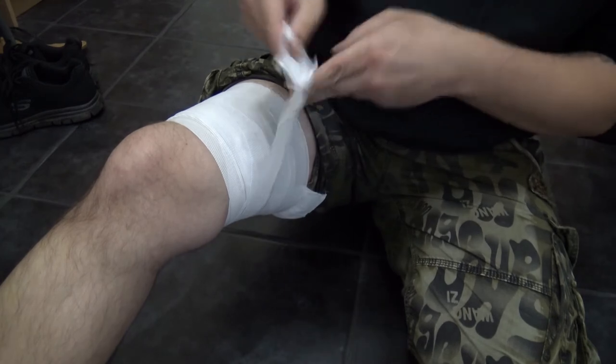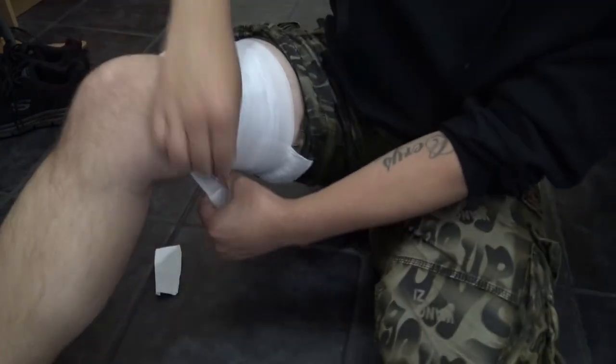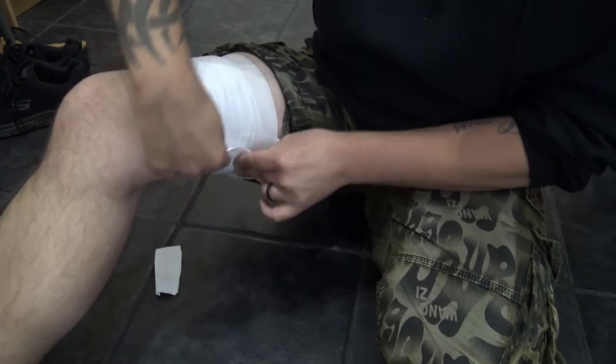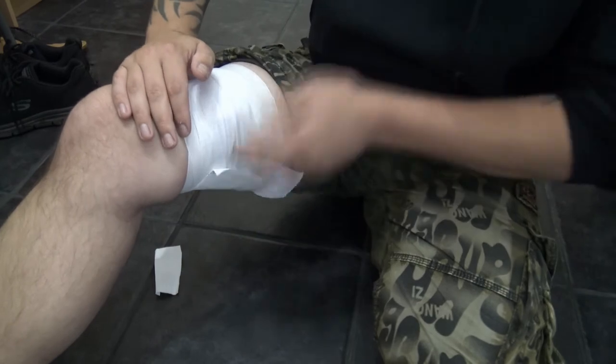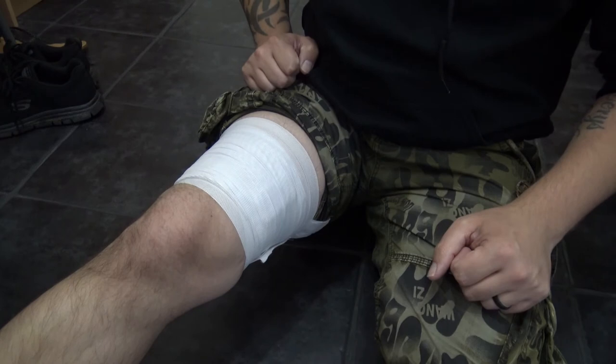You can really feel that elastic doing its job. When you reach the end you will find the Velcro and you can simply attach it — it will be held securely. Simple as that. That is how you apply the Trauma Fix trauma dressing to a wound.